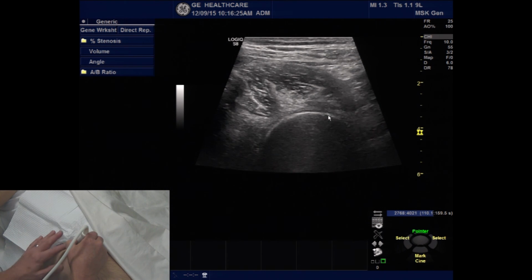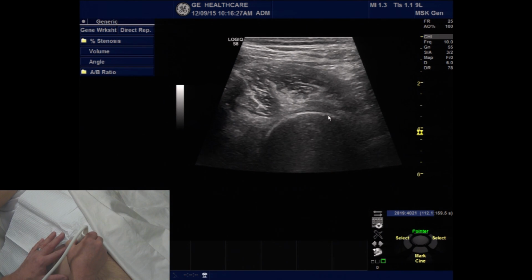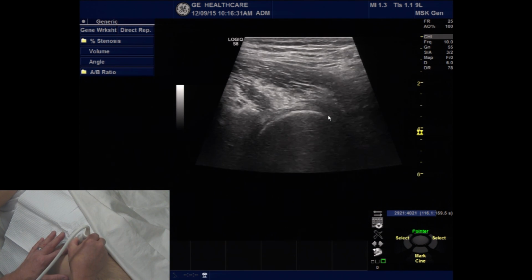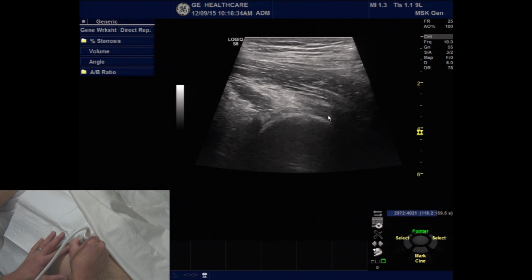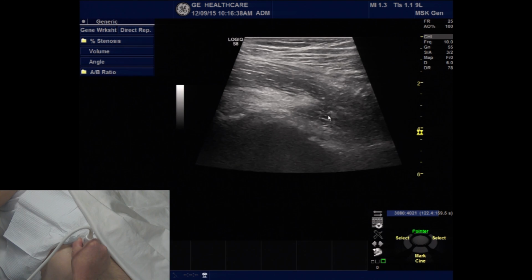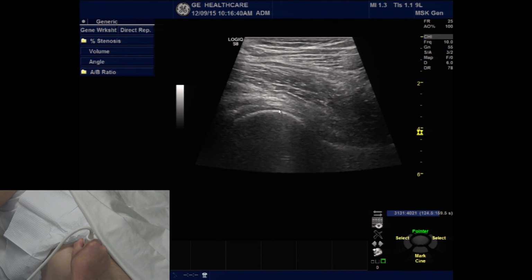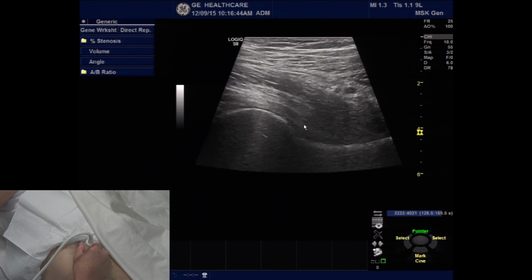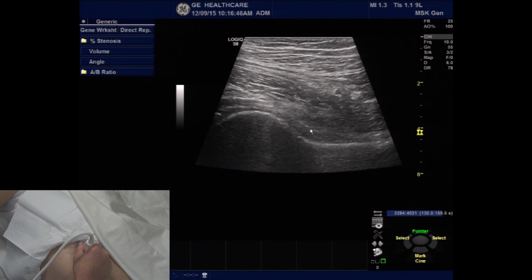To get into the position for the injection to see the femoral head-neck junction, I simply rotate the transducer in a clockwise fashion, keeping the femoral head in view, and until I see the typical landmark of the femoral head-neck junction, and I can see the capsule of the hip sitting just superficial to that area.